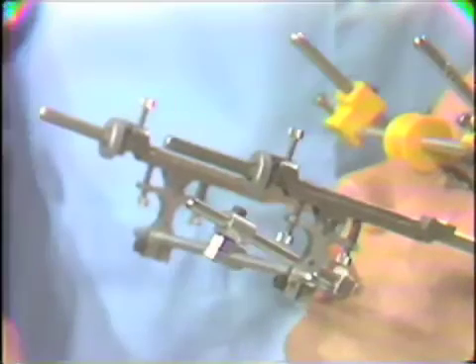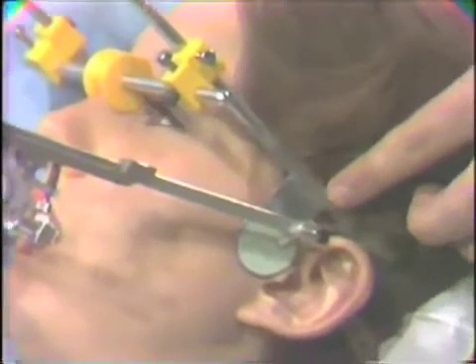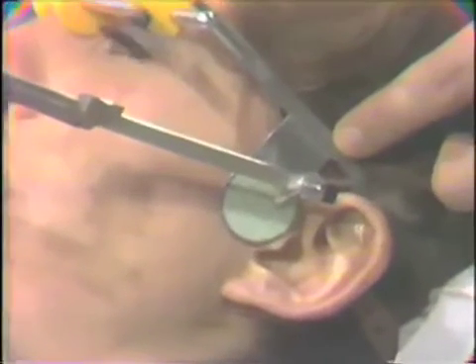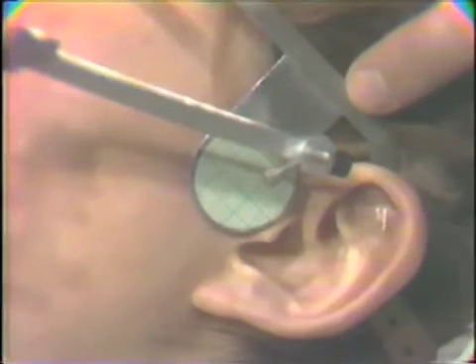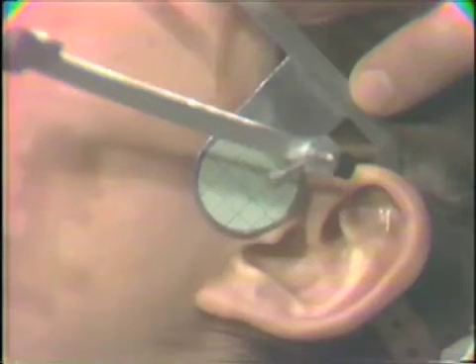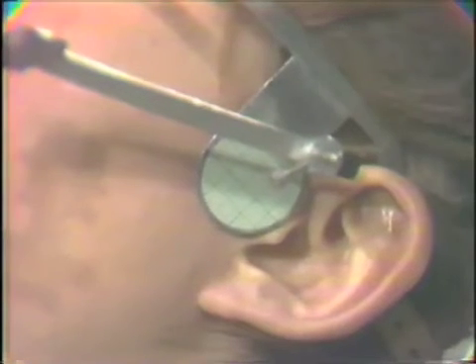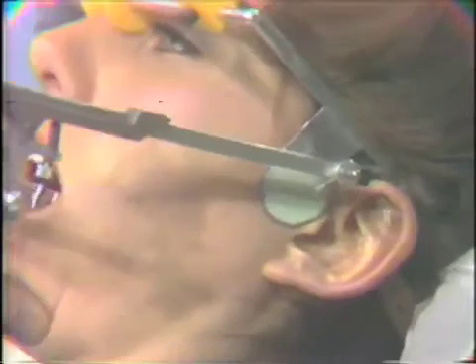Now, posterior to this, we have the upper member, as you can see below the pointer, which contains the grid for the actual location of the hinge axis. Now, the technique involved is basically the same as most techniques anyway, for locating hinge axis. The mandible is put in the retruded position and opened and closed on an arc around that position.